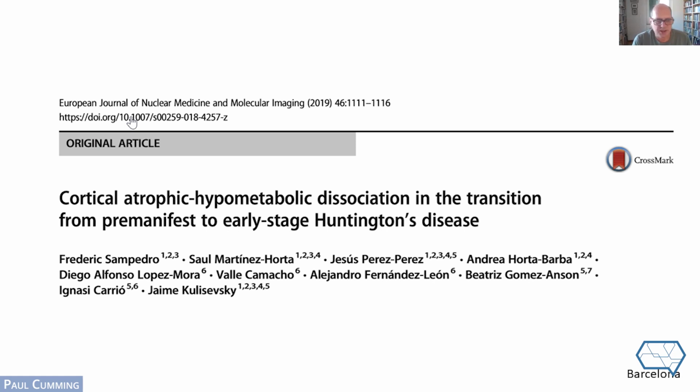Now, of course, this is not necessary because anyone can get screened genetically to see if they have the CAG repeat mutation of Huntington's disease. But it's still an interesting question about when the disease really starts. Can you use PET to detect changes in metabolism that might precede the onset of the disease, or distinguish between the preclinical state and an actual clinically manifest Huntington's? Next slide.